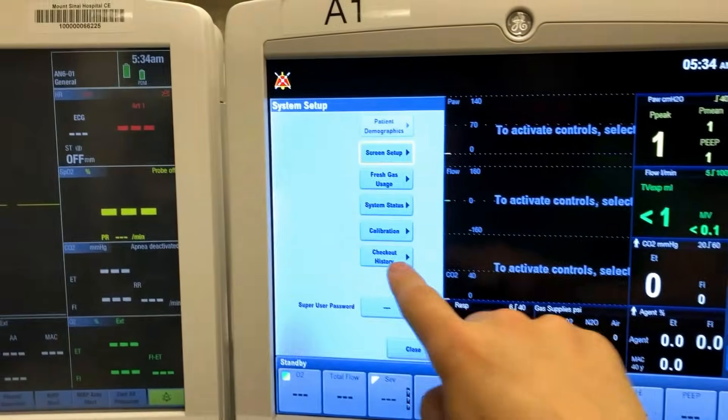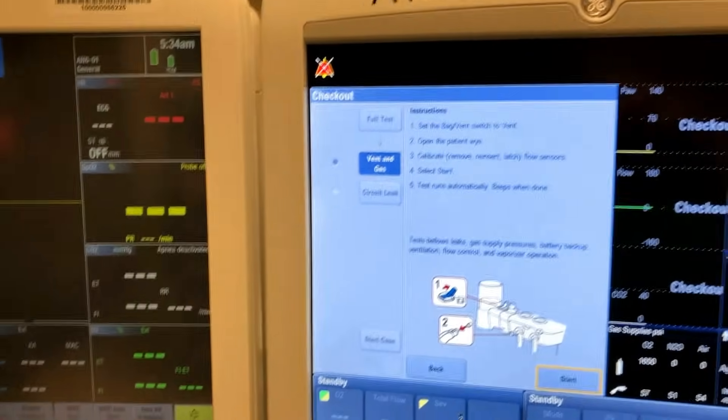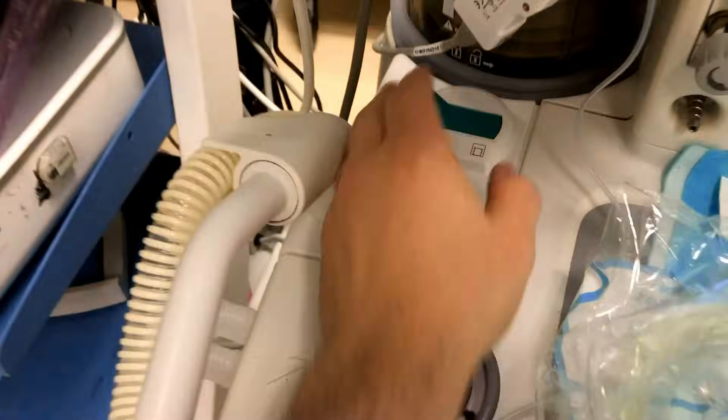The next part of making sure my machine is ready is doing a machine test. I'm going to start a full test which requires that I'm on vent mode and that I've got my Y pipe disconnected.